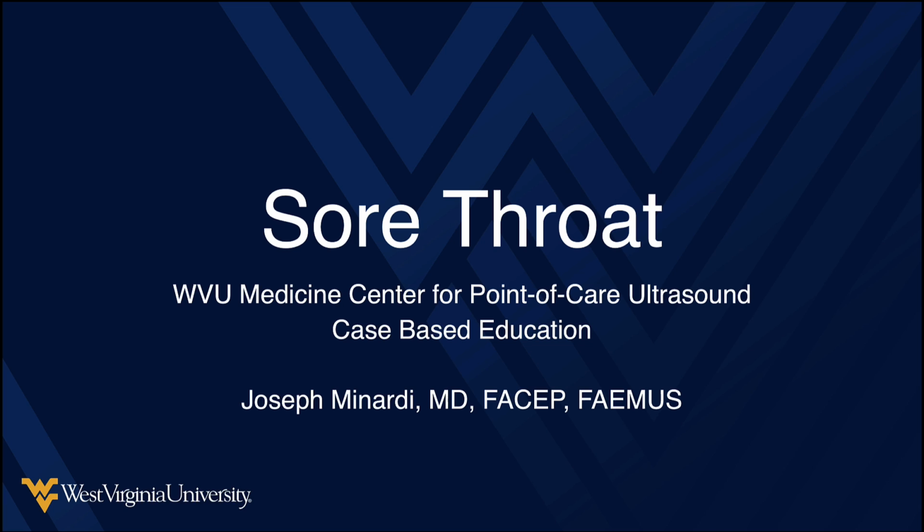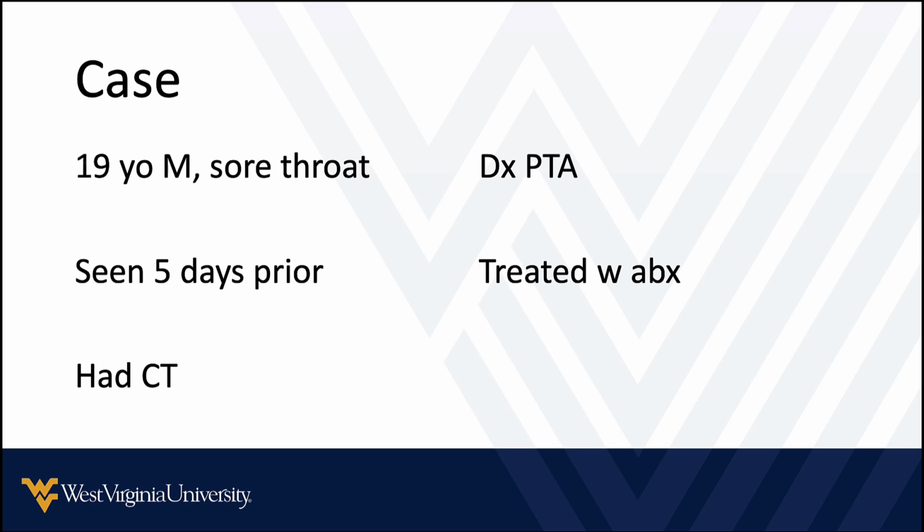I am here to go through a quick little case-based point-of-care ultrasound topic with you all today. This case is about a patient with sore throat. So let's get right into the content here. This is a 19-year-old male who presented with sore throat.